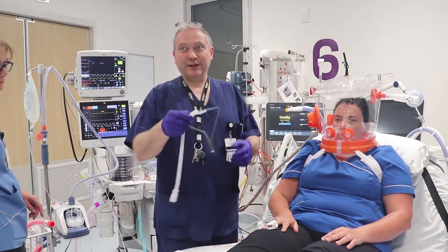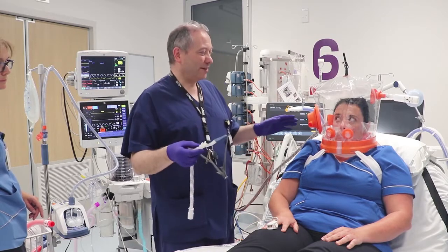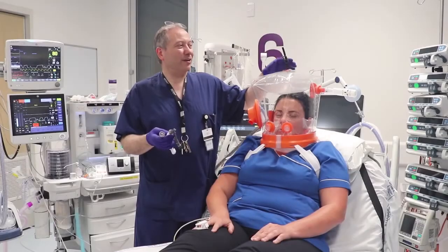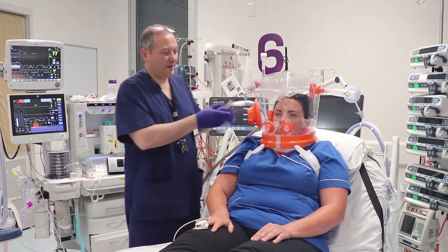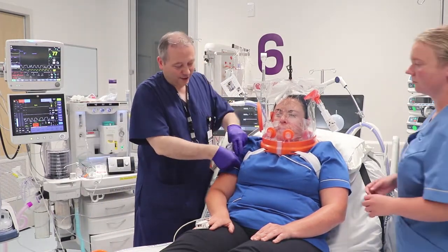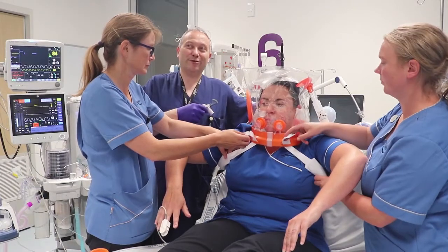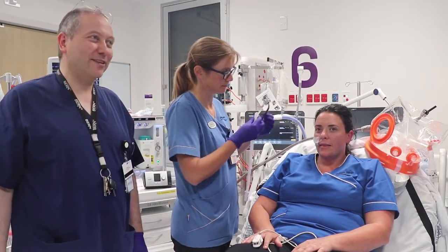Next we are going to apply the Fischer & Paykel ERVO2 nasal cannula to the patient. To do this, we temporarily remove the hood — deflating the top cushion, removing the free breathe valve, and having Louise and Sarah lift the helmet off using the straps. We also deflate the rear cushion. Louise is then going to apply the nasal cannula to Carla — it's always best to have someone who performs this regularly.